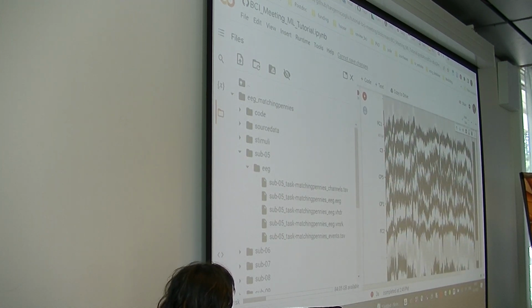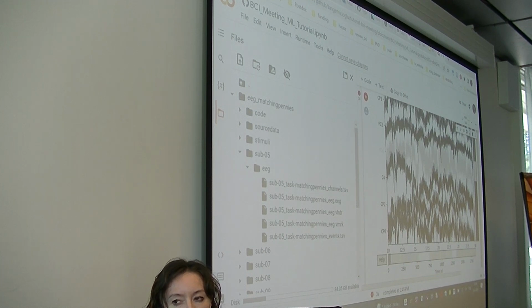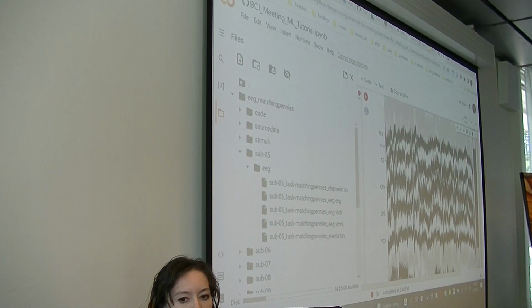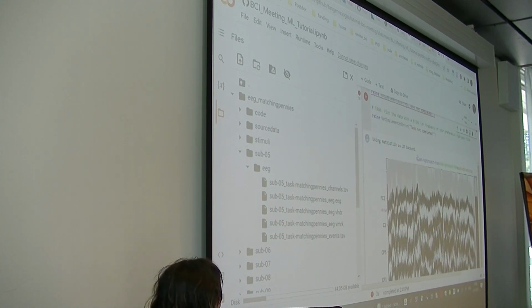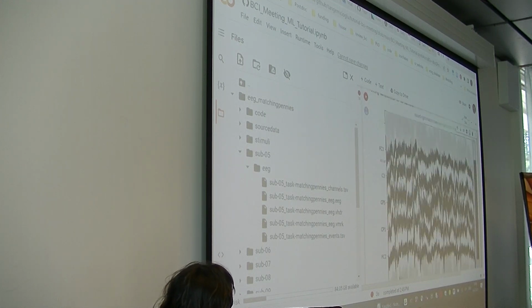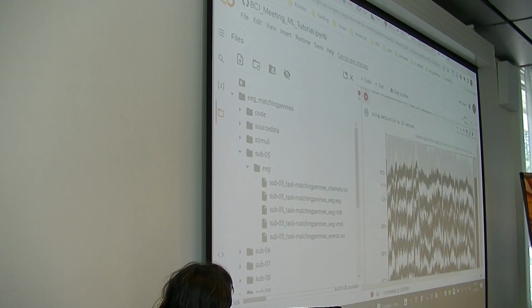The visualizations would be interactive if you were doing it locally, but we can't really do remote interactive visualizations on Colab, unfortunately. And if we move here, you can see that we have 3 events within the span of the 20-second window that we put here. And we can see each of the channels with the bad channels hidden being visualized here.